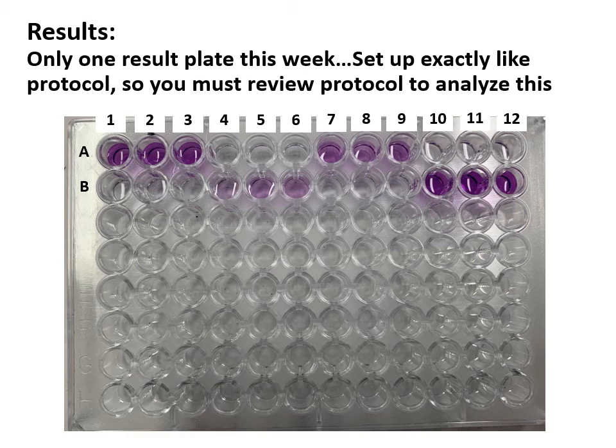And like I said, you'll notice that some of the results end up looking a little lighter than others. And you may want to ask yourself, what does that tell you about that patient sample? What could have happened to cause lighter versus darker reactions? And again, asking yourself, what exactly is causing these reactions?